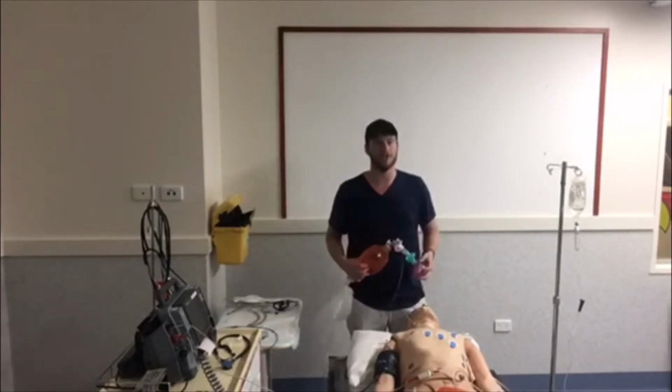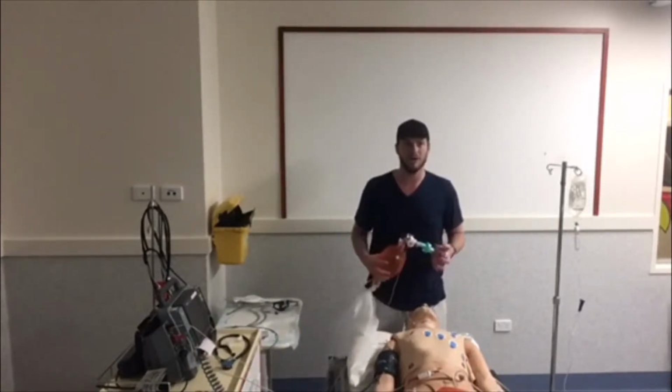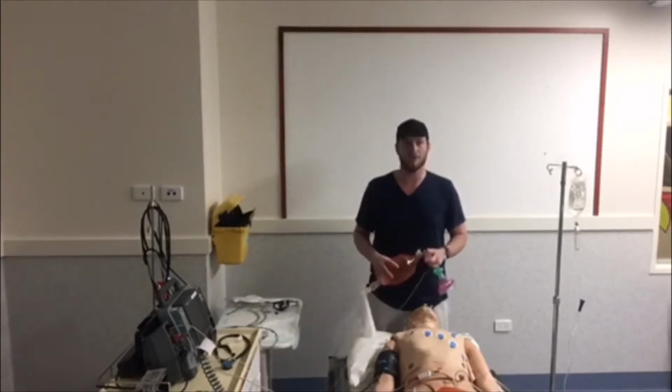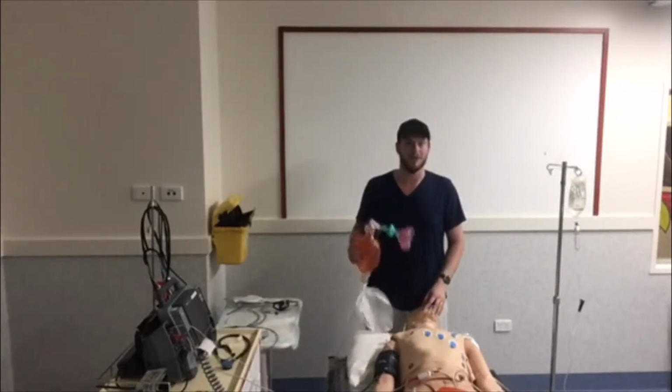So first up, pre-oxygenation. So we've got a bag valve mask. We can have some PEEP if we want to as well. End-tidal is connected to our monitor. At the moment we've got a LIFEPAK 15, and we've got an OPA at the moment with nasal prongs.